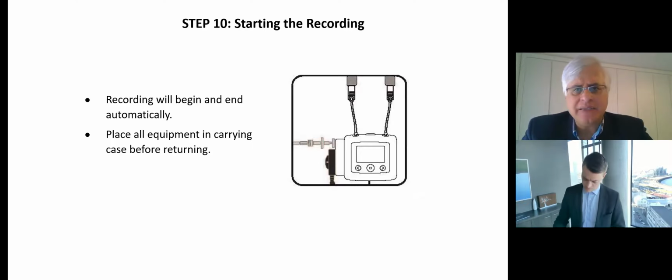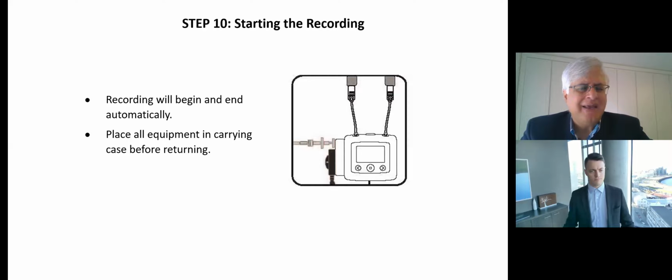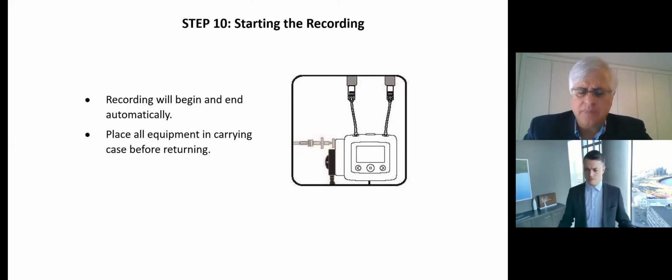And then again, we remind the individual to start the recording, or in this case, what we have done is we've actually configured the recording to auto start because I think it is easier. In the clinic, we ask them, what time do you plan on going to bed? And typically what we do is we start the timer for the monitor about 30 to 35 minutes before their designated time to bed. And then the monitor continues and we configure it to record for 12 hours. Even if they take the monitor off and the battery still has charge, it'll continue recording. It'll just be a no signal from the standpoint of EEG or the other inputs.